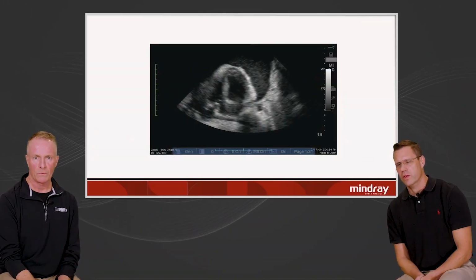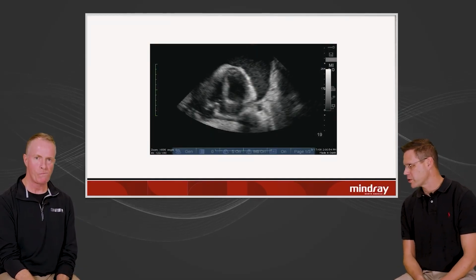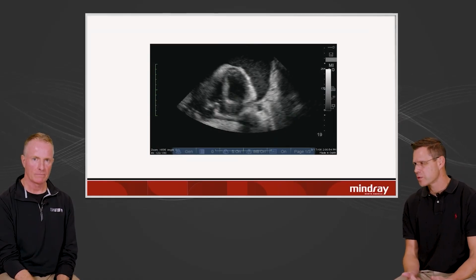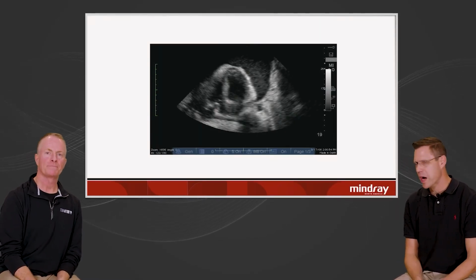And I think throughout the time that we've been practicing, you've seen that progression from the blind approach to the apical approach with the phased array, and then more recently being able to use a linear probe and actually see your needle the whole way. As we do more and more needle-guided procedures in the ER, it just becomes another spot with fluid, and it's much less intimidating.